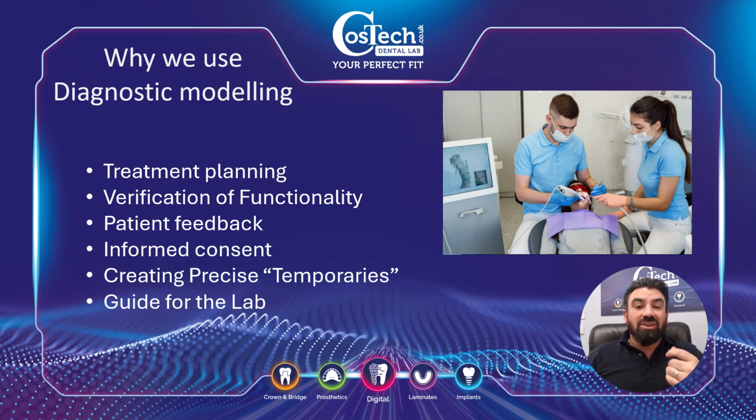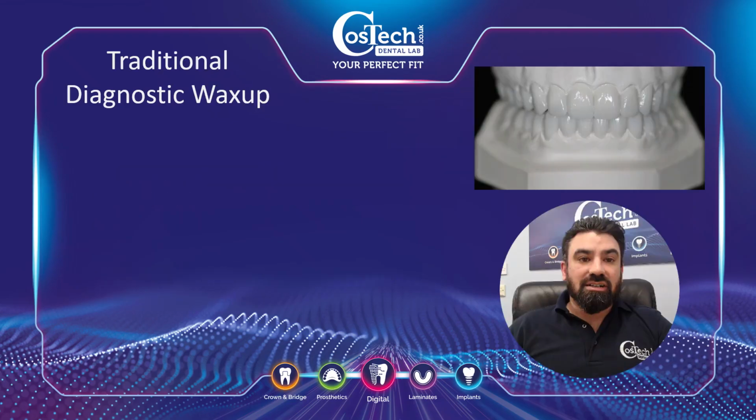Also, it becomes the guide for the lab. As soon as we've done the whole diagnostic tool, we will be using that from start to finish as our reference. And just also when we're using now the digital side, what we actually do at the diagnostic stage actually becomes the final restoration at the same time.